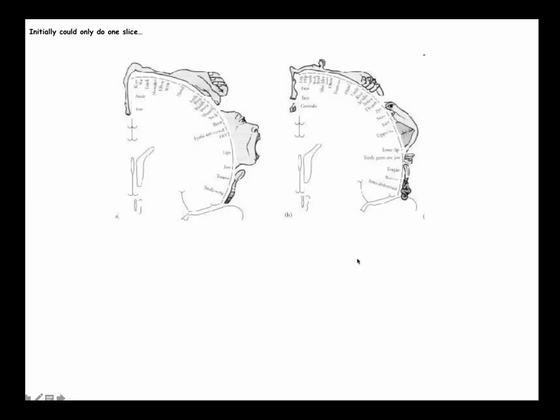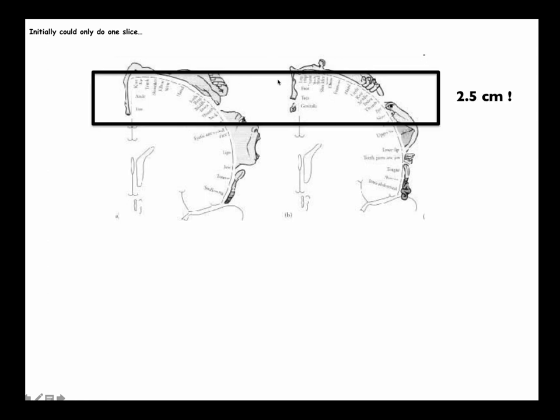And it worked pretty well. So this is our first experiment. I basically pulled out an anatomy book and looked at a coronal section and said, okay, where do I pick? Because we only could pick one slice at a time. So I said, let's just pick a big slice, 2.5 centimeters thick, just getting a chunk of the motor cortex right here. And that's what we did. TR was 2 seconds, TE was 50 milliseconds. We knew to have a longer TE to optimize it to the T2 star changes. That's at least one thing we gathered from the ISMRM meeting before. And this is the movie. This is an early movie from an axial slice of my brain.